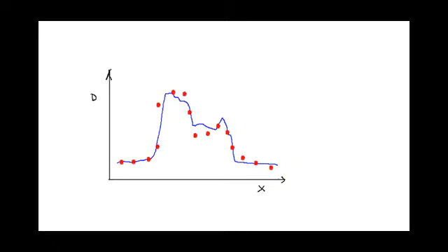So how do you analyze this? The problem here is that if you look at a particular point, it can actually be quite distant from the measured dose, even though you can see that it actually isn't deviating that much. It's just that it's in a high gradient region, but it's close to the planned dose in this region. So you need some way of accounting for this and analyzing it.